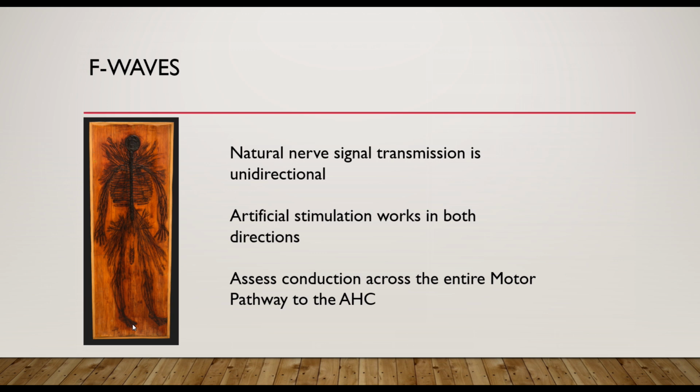Now, these were first described in the foot, that's what they're called F waves, but if you were to stimulate someone's nerve down over here, for example the tibial nerve, not only will the fibers going distally to, for example, the abductor hallucis be stimulated, but some of the signal will be travelling up as well, and it will also be depolarizing some of the anterior horn cells, tickles them a little bit, sets them off, and then they in turn send a signal back down again.